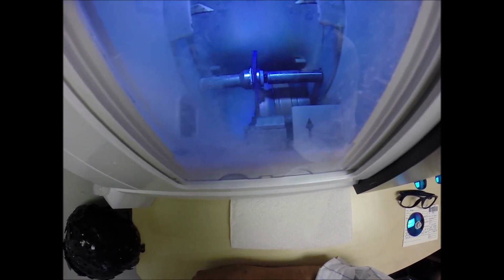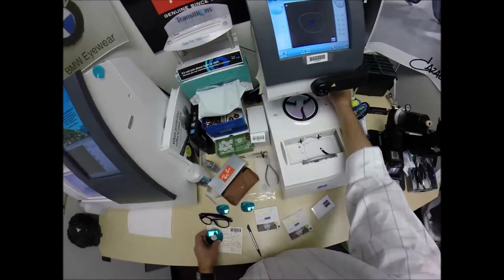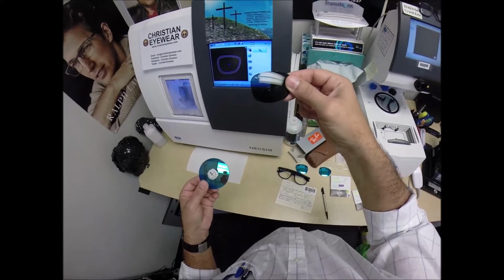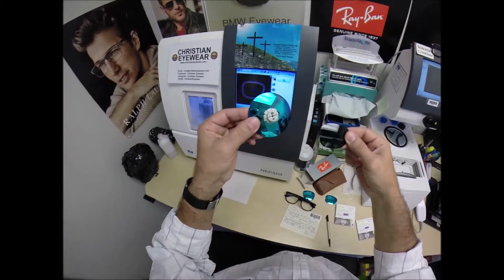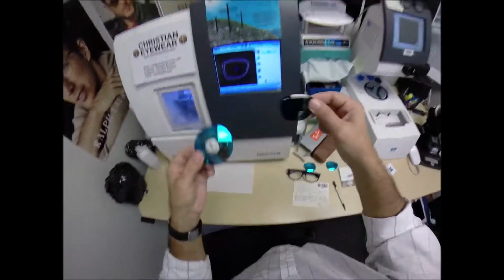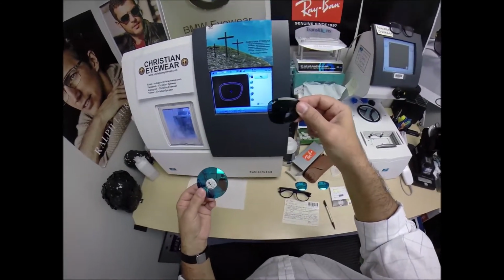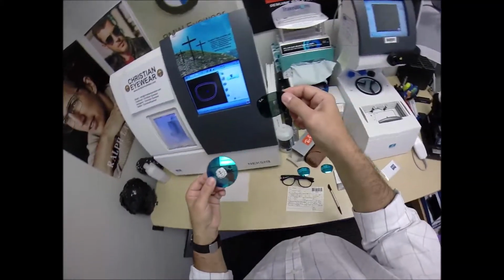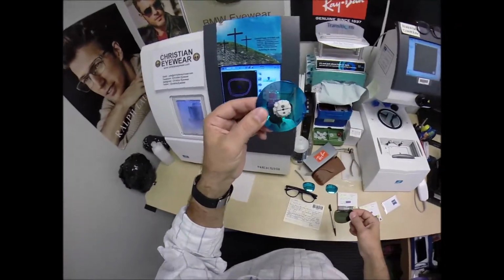Now, you can see the swarf on the outside of the lens. A sunglass lens, a dark lens, absorbs the sun's rays from entering into your eyes. A mirrored lens reflects it back, making it 30% darker than just a tinted lens. Now, you can get the mirror on a tinted lens or a polarized lens.